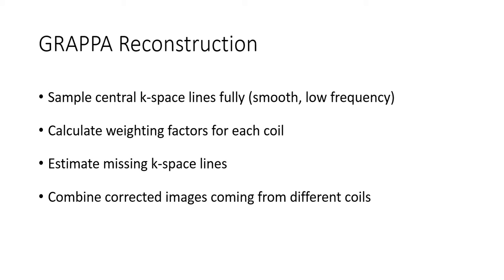Once we do that, we can combine these corrected images coming from different coils and ultimately reconstruct the final alias-free image, hopefully without any noise.